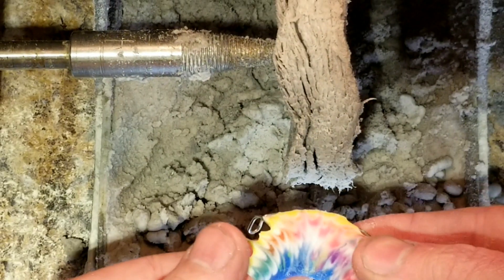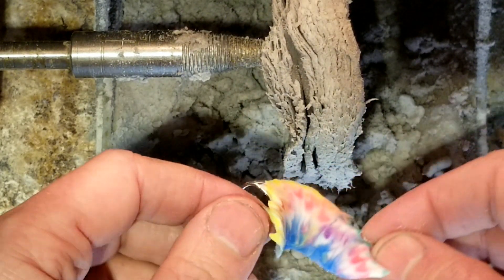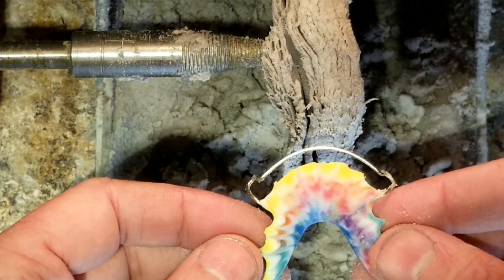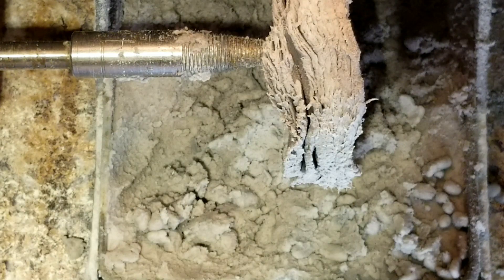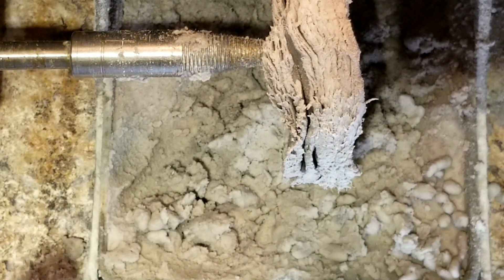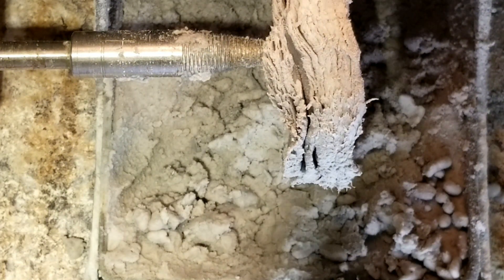The idea is to get the right pressure onto that rag wheel safely and to do this as fast as possible without any physical damage — take all the scratches out and be ready to polish. I came up with a method, and this is something that anyone watching this will learn. You'll be able to teach your employees — just say, hey, watch this video, do exactly what Steve says, and you'll master this. You'll be pumicing these things in no time, perfectly, effortlessly.